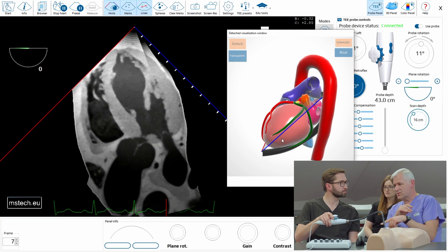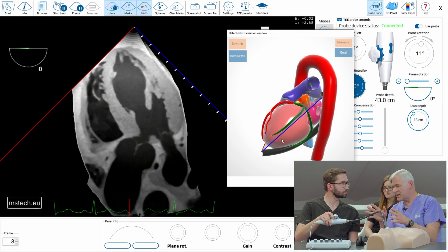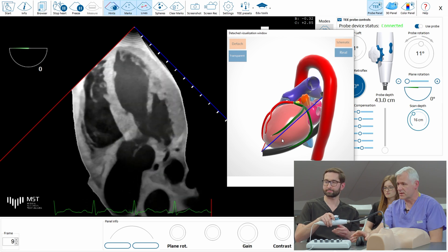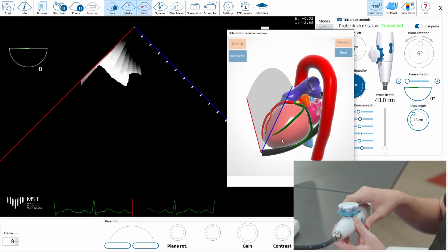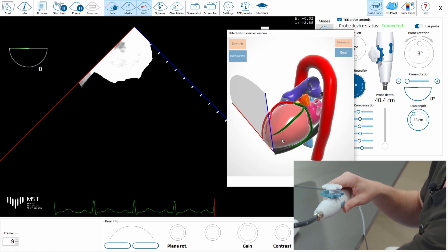OK, so let's just try. I will just leave you alone and try to repeat all that we've done until now. So of course, the patient is very patient, fortunately.